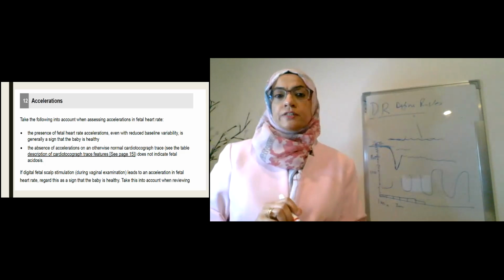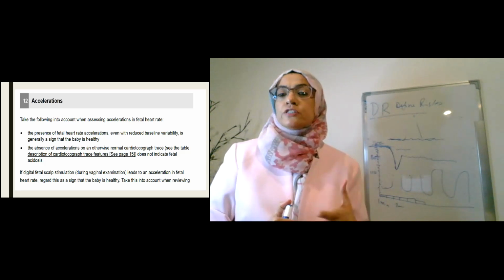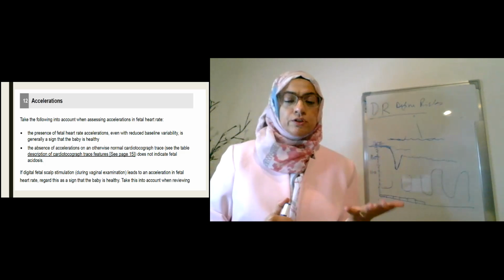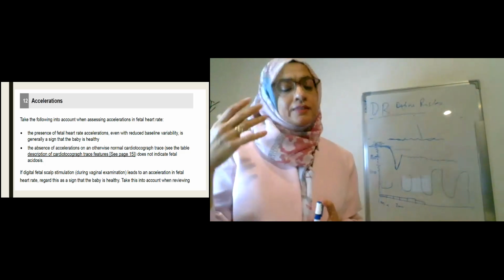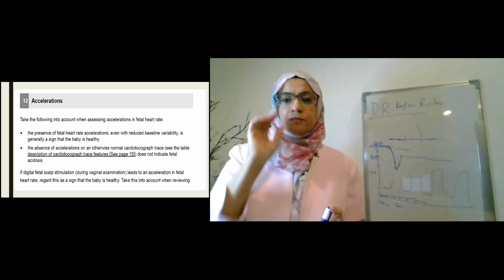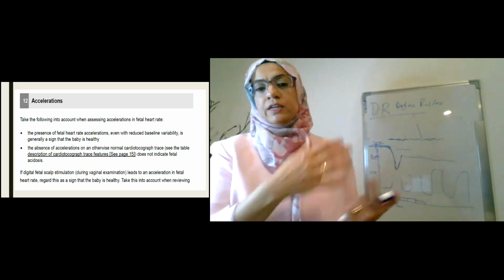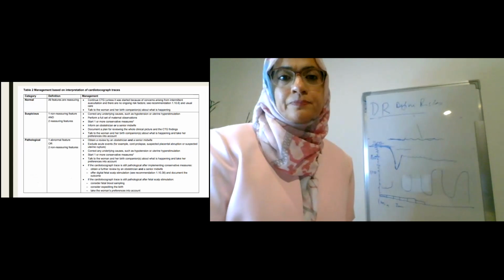Again, the absence of acceleration on an otherwise normal CTG also does not indicate fetal acidosis. So you have your other features with no decelerations and a good variability. You can wait on that baby. And sometimes we know how to wake babies up. We go and tickle its head, give the mom some cold water, change the mom's position, and the baby then moves around, and then we can get an acceleration. So we have got tricks to do that.